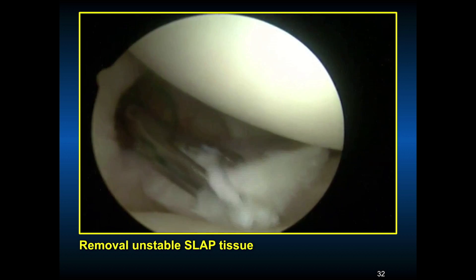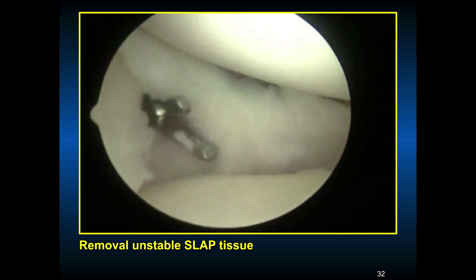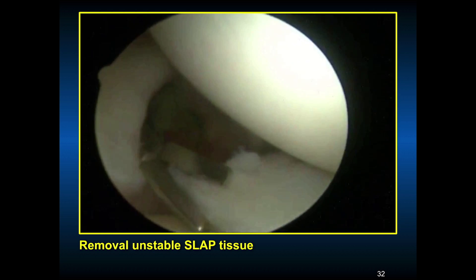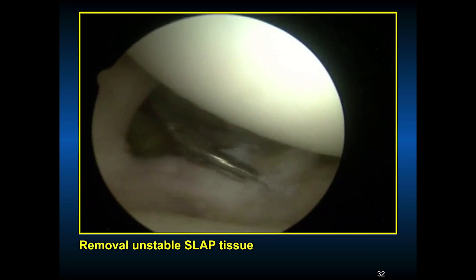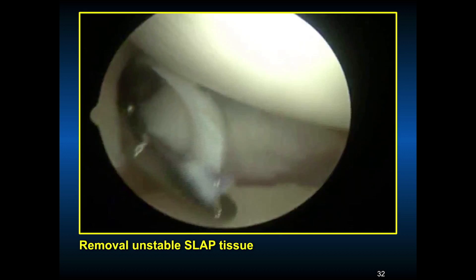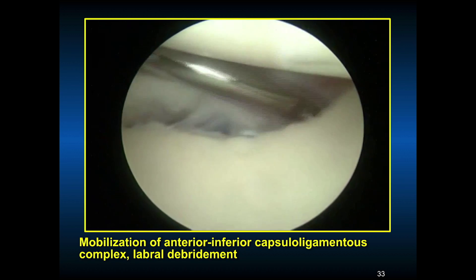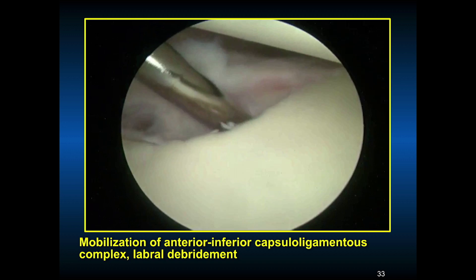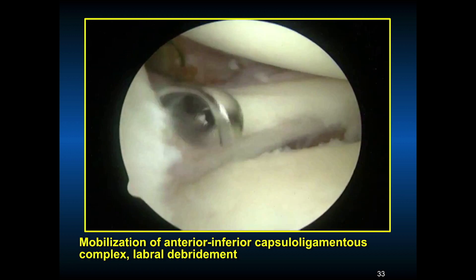If the labrum is debrided and the biceps is unstable, then a biceps tenodesis or tenotomy is done. Now that the piece is transected and the unstable SLAP tear is out of our way, we can mobilize the anterior inferior capsule ligamentous complex. Prepare the glenoid again, and now we can reestablish that normal soft tissue lip of the tee anteriorly.